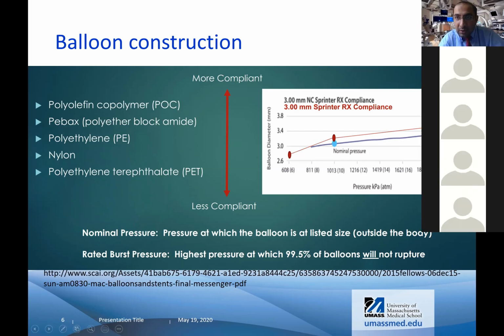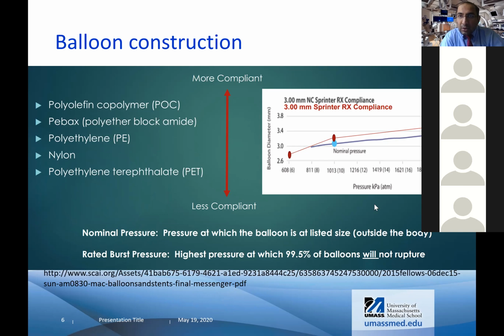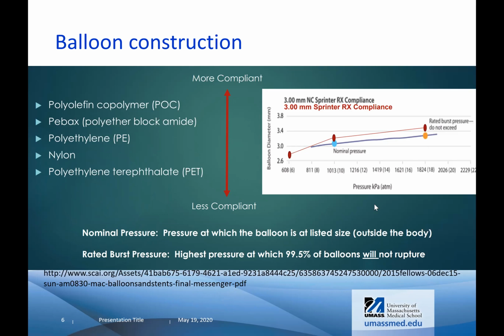Okay, that's good. Saying the compliant and non-compliant balloons, is that the same thing as cutting and non-cutting balloons? No, they are different. That's a different thing. Okay. Yes, and I will go over those too.